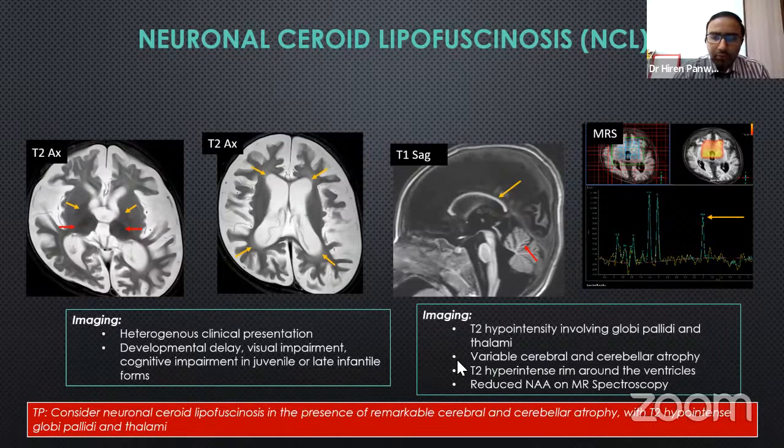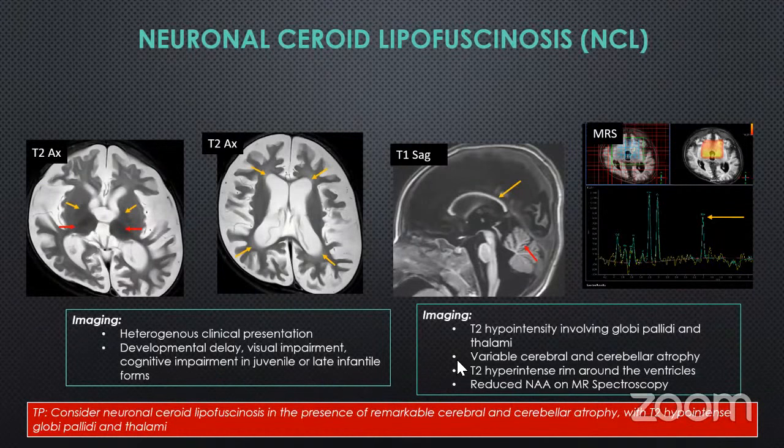But if you are looking for mitochondrial and those kinds of disorders, it is ideally recommended that we should do 144 TE also, just to look at the inverted lactate peak to be more confident about it. And in older children, what I have seen is that MR spectroscopy at 144 TE would suffice in most cases, if we are short of time.